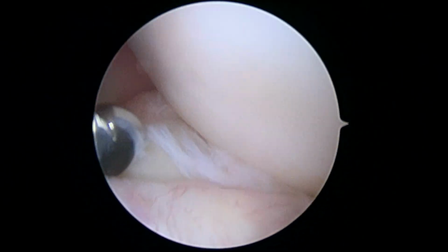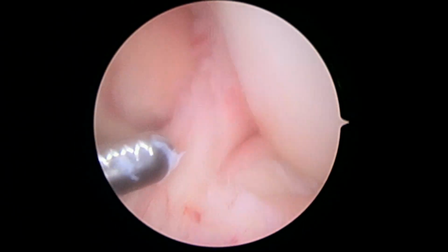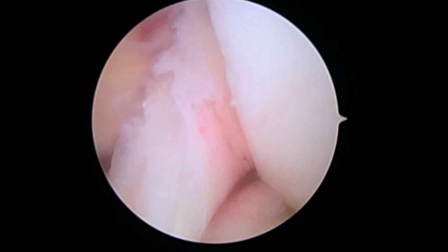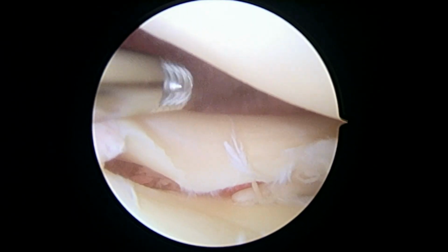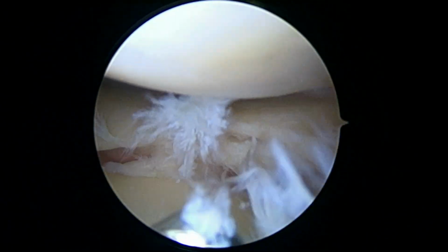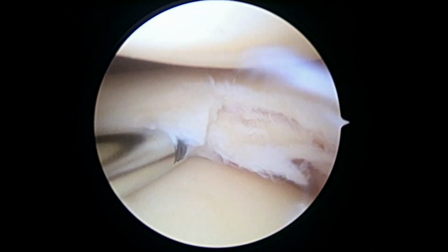So the next step is to go ahead and start to get a look at this lateral compartment where we think most of the pathology is. We'll go off on the video in just a minute. Table down just a little. Okay, so this is the lateral compartment, and it's not hard to see all the damage to this meniscus here. See all these torn things. And we'll have to see how much of this is fixable once we get out the parts that are not.